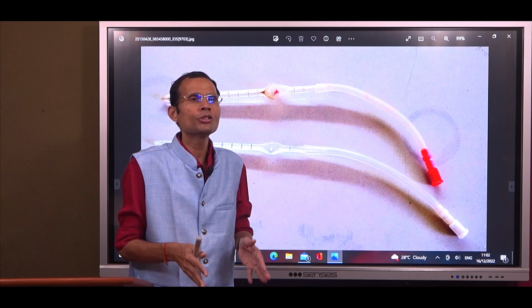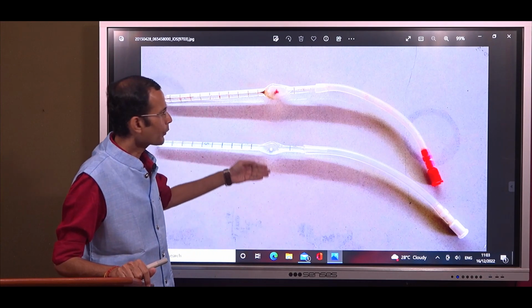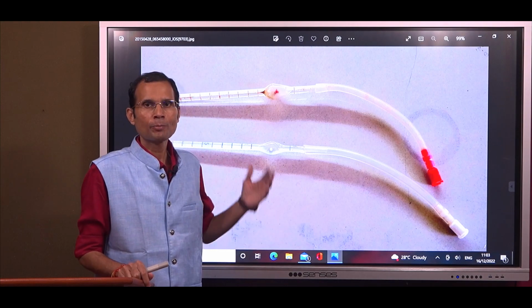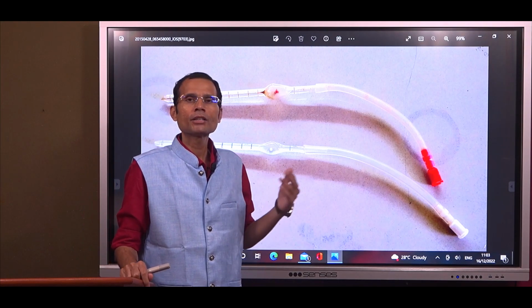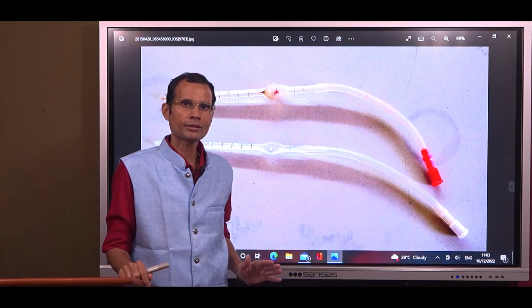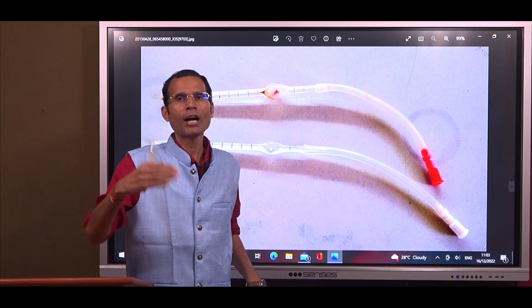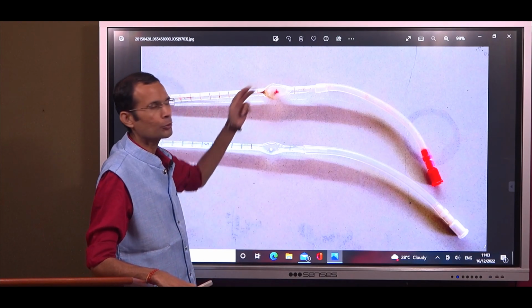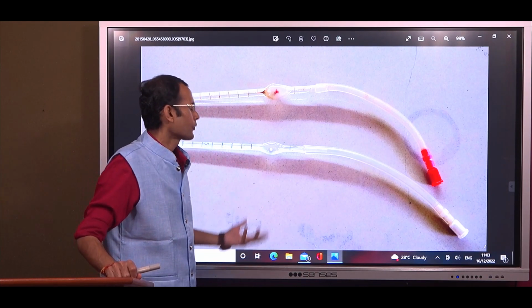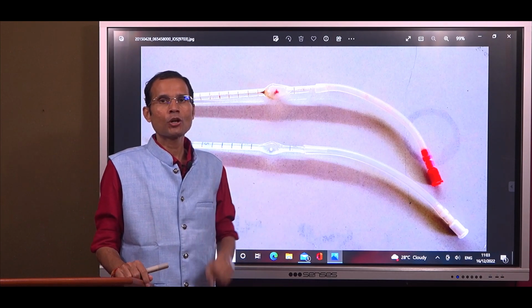They can be used to dilute any fluid by either 20 times or 200 times. Okay, we are using it for blood sample dilution, but they can be used for other purposes. Semen sample dilution, for instance, these pipettes can be used. Anything, any fluid, if you have to dilute it by 20 times or 200 times, we can very well use these pipettes.